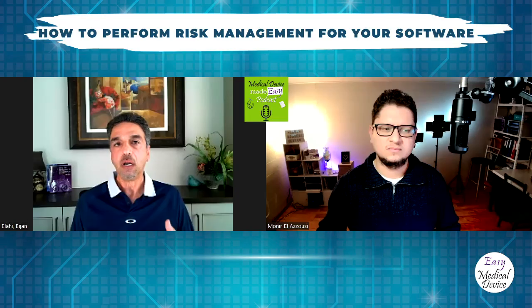But this can be an advantage for you. Other advantages are you have the ability to monitor how your software is being used. You can track faults that are being created, see whether your users are making mistakes, and these things can help teach you how to make your software better. So these are the advantages of software and SIMDs.